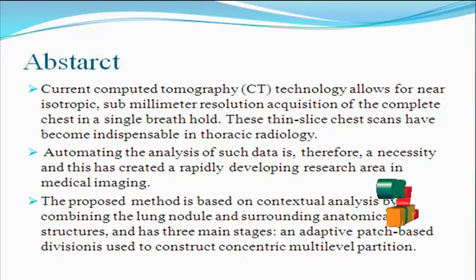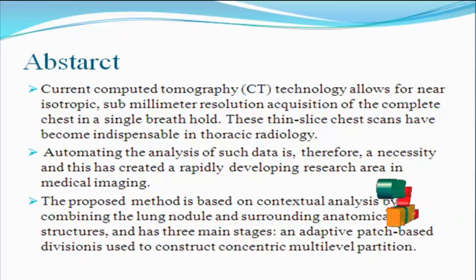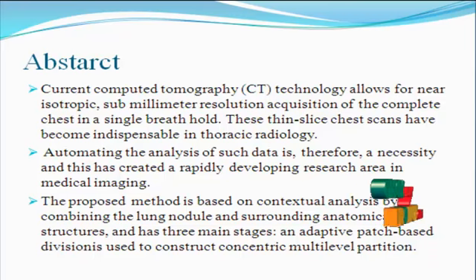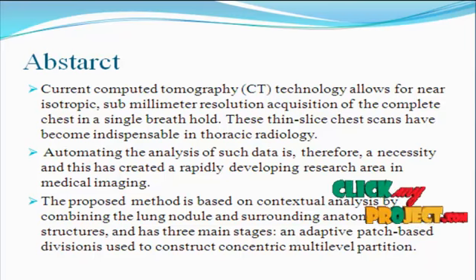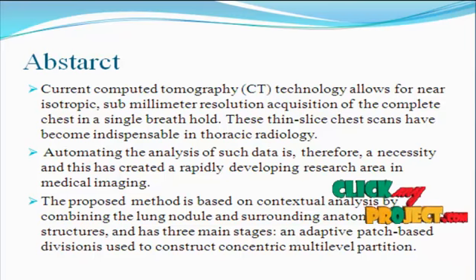We evaluate the proposed method on low dose CT images from LIDC. Our results show there is more overlap between the well-circumscribed and juxtavascular types and between the juxtapleural and pleural tail types. Also, quantitative comparison among the various methods demonstrates highly effective nodule classification results to identify the overlapping nodule types.